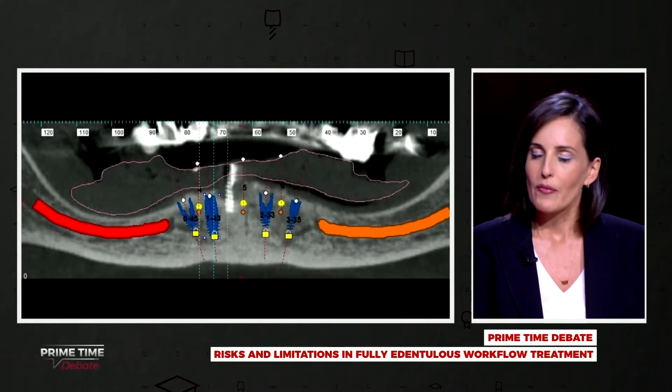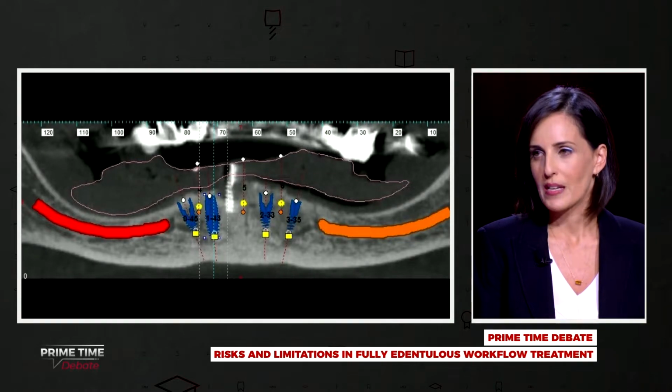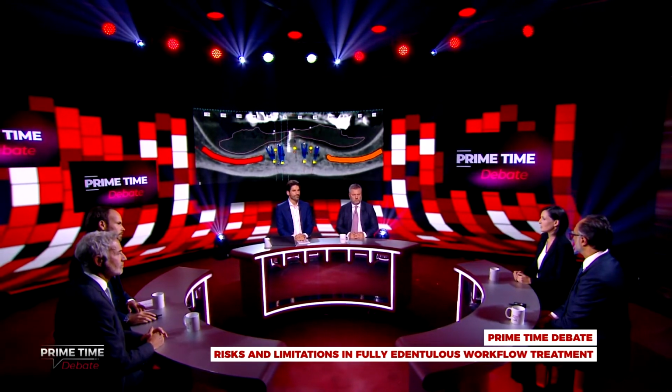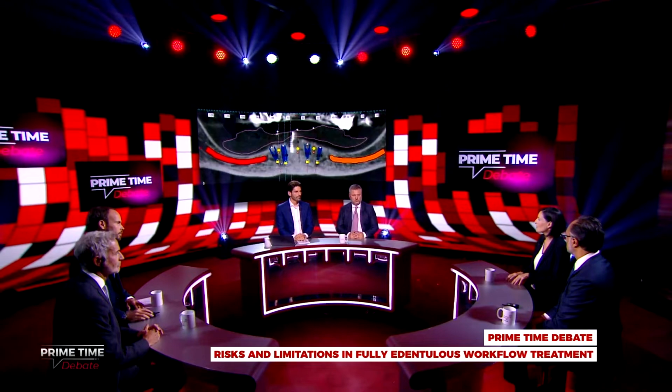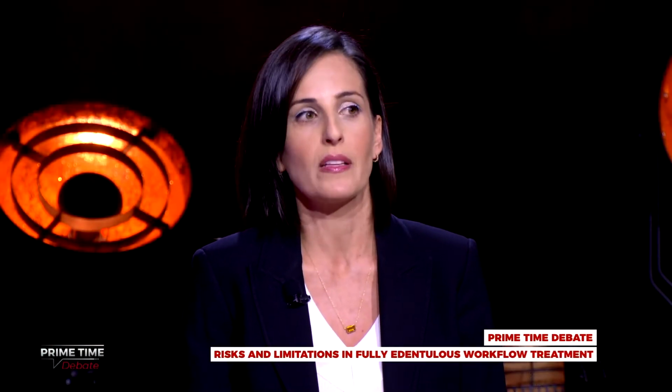So whenever we are talking about guided surgery, not only does the surgical work have to be very meticulous, the prosthetic preparation also has to be really meticulous, taking into consideration all the small details so the final result will be accurate. Sergio, how do you approach this setup of the teeth when you have no reference points?